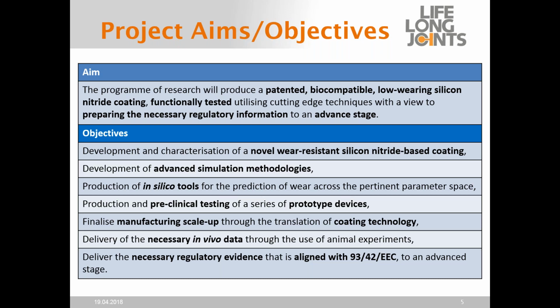The problem with these is that to gain one data point takes about 3 months worth of experimental work. What we want to do is be able to predict the wear in a considerably shorter amount of time and do it for different configurations of loads and motions. And this is where the in-silico tools come into play, and where we've interacted with Anybody technology to try and achieve this particular objective.